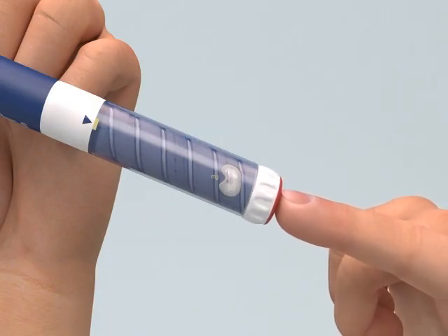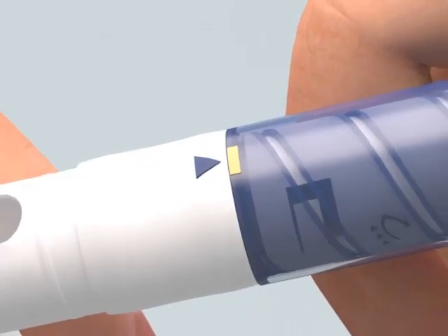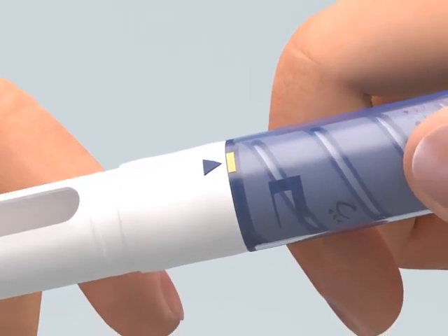Be sure to check that the cartridge holder is still attached to the pen body with a blue arrow lined up with a yellow or white mark. If so, the right dose can now be dialed.